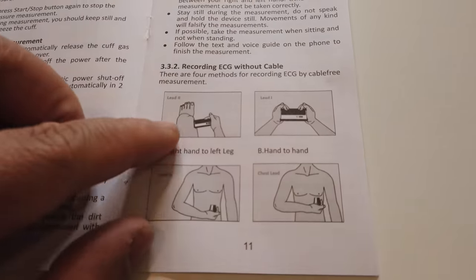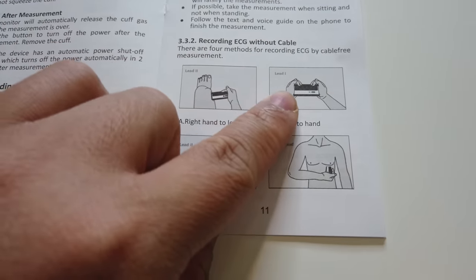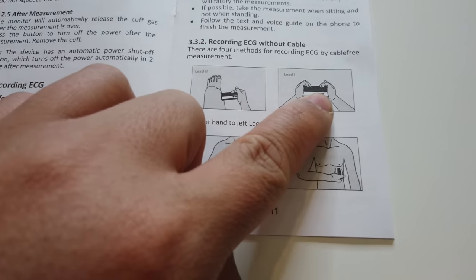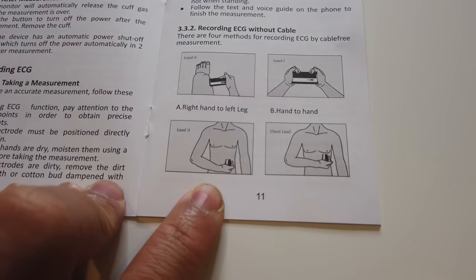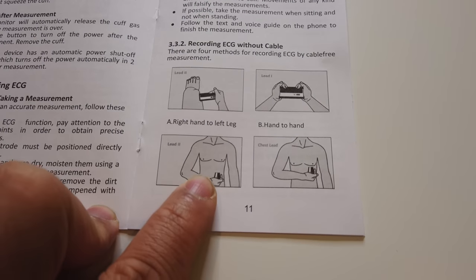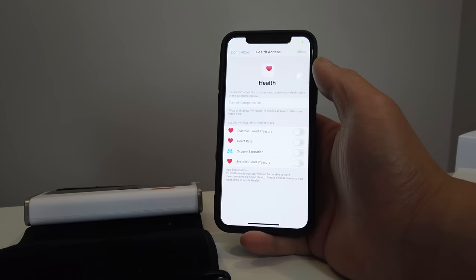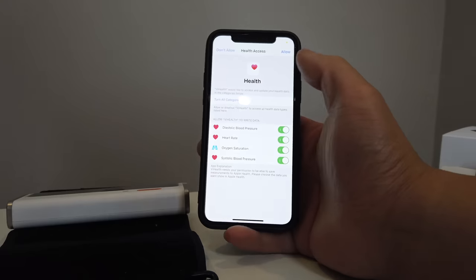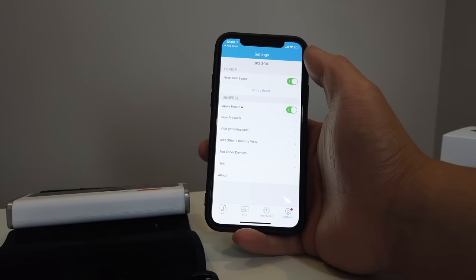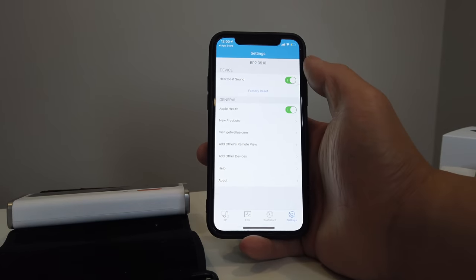The instructions show there are different ways to measure your ECG. The one we did is Lead 1 — hand to hand. There's also right hand to left leg, and there's Lead 2 and a chest lead as well. You can also connect this to your Apple Health — if you're into that, you can turn that on and everything will be synced to Apple Health.